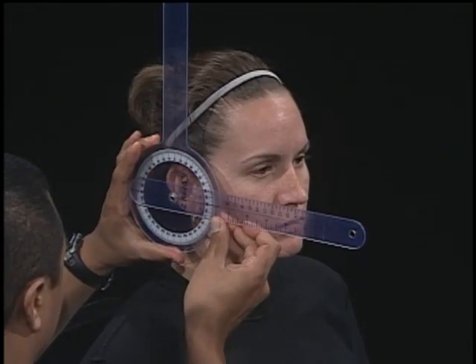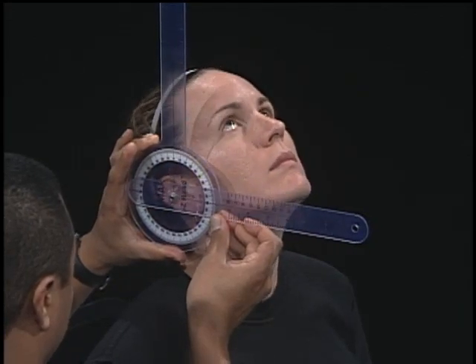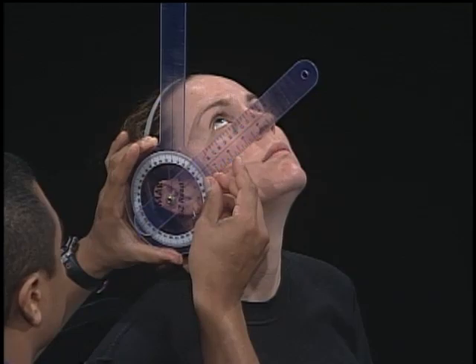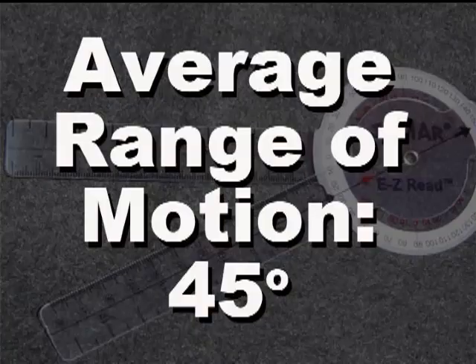Measure twice. If the measurements are off by greater than 5 degrees, take a third measurement. Take the average of the measurements and document it in the patient's chart. Average range of motion according to the American Association of Orthopedic Surgeons is 45 degrees.